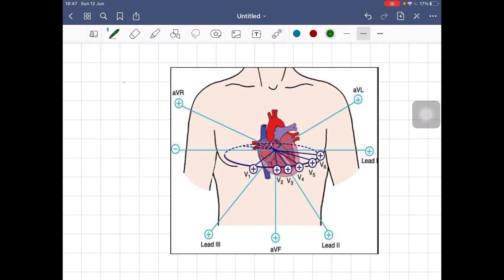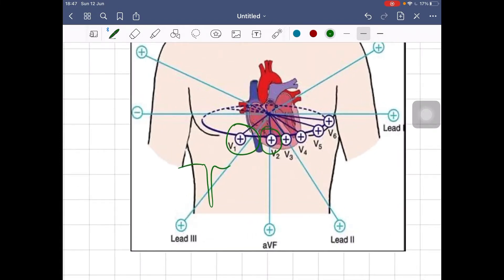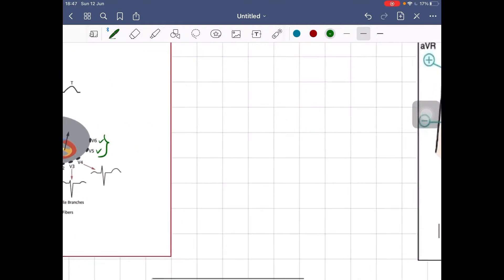Looking at the leads on the right side of the body — V1 and V2 — these leads will show a prominent S wave or negative deflection. Because of LVH, the majority of current is directed towards the left side, in a direction opposite to V1, which is why they will show S waves that are much deeper than normal.